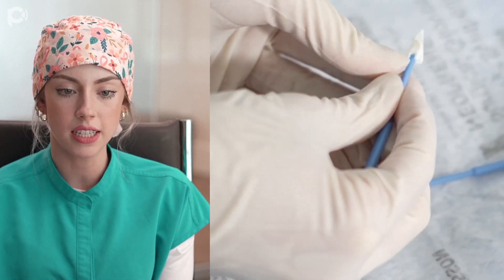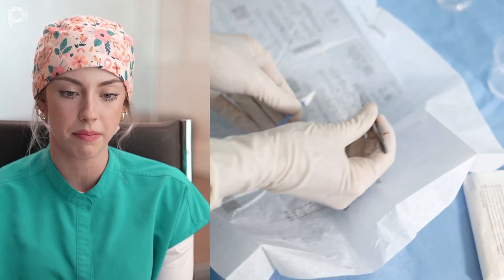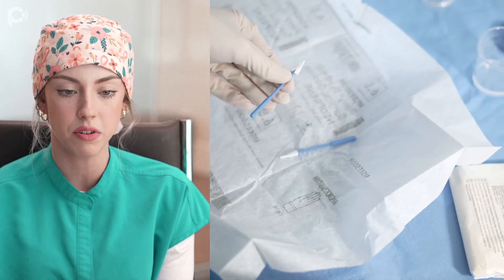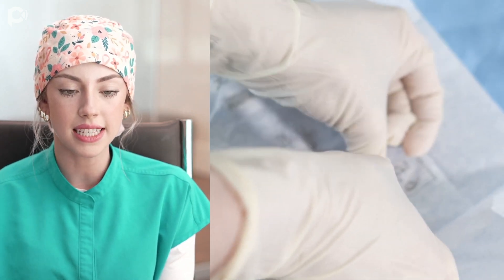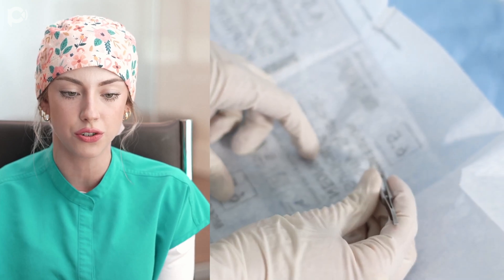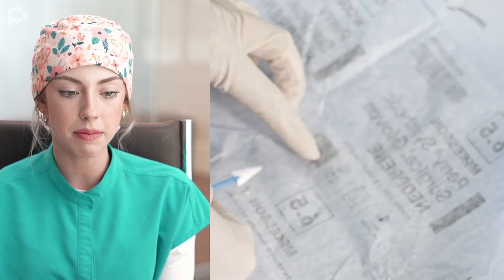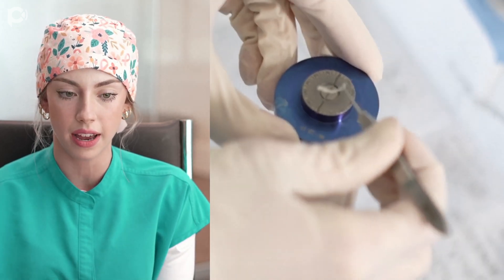Next, I'm just going to start drying the tissue with some WEX. This is a clean surface — this is the tissue that my gloves came in — so I'm just moving it to a new spot with the .12s and then pressing down with the WEX into the table, just trying to dry it off as much as possible. I do this about three to four times just to get it as dry as I can. You're not going to be able to dry it all the way yet.